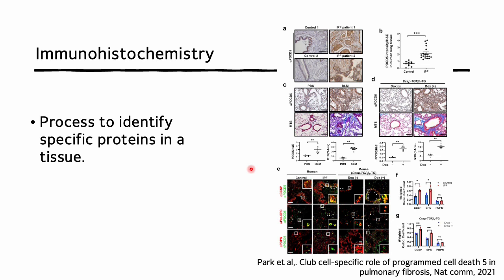And then we go over the deparaffinization step, and as in Western blot, we go over blocking, we attach the primary antibody and the secondary antibody, and we detect the signal. Another advantage of immunohistochemistry is that you can see the localization of the protein.